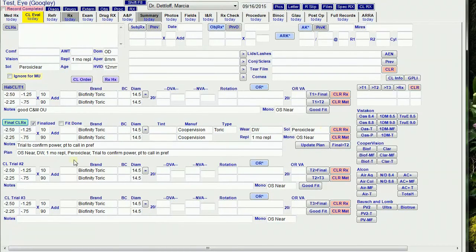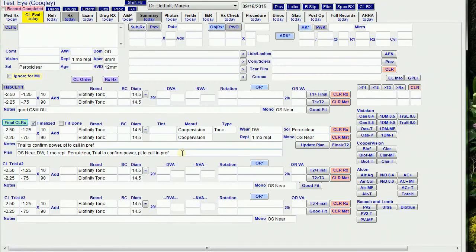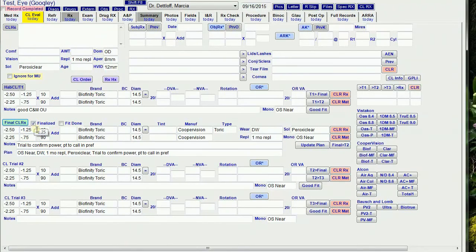It copies the mono, wear, type, replacement, solution, and notes into the plan, and it checks the finalize button so I know it's been transferred to the RX tab.